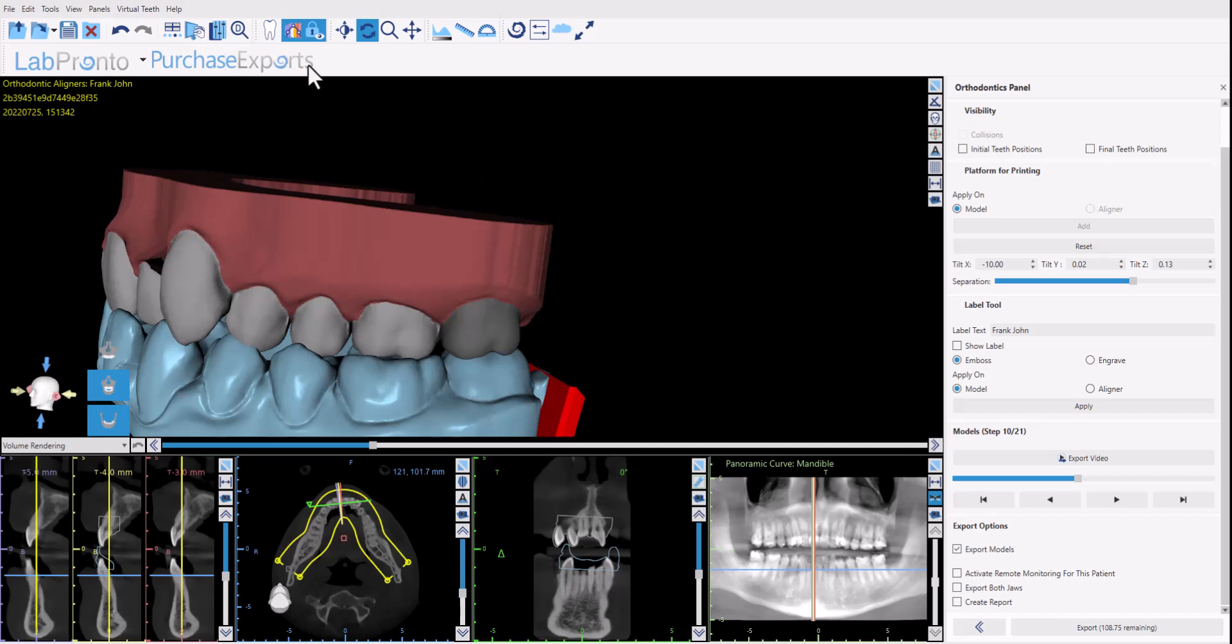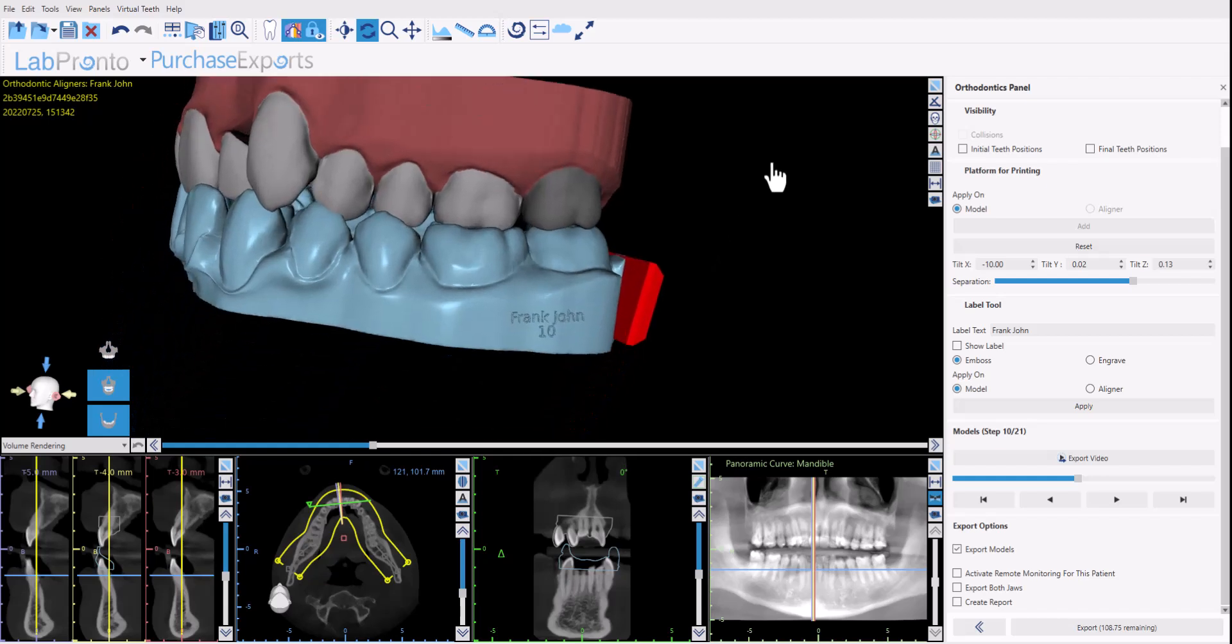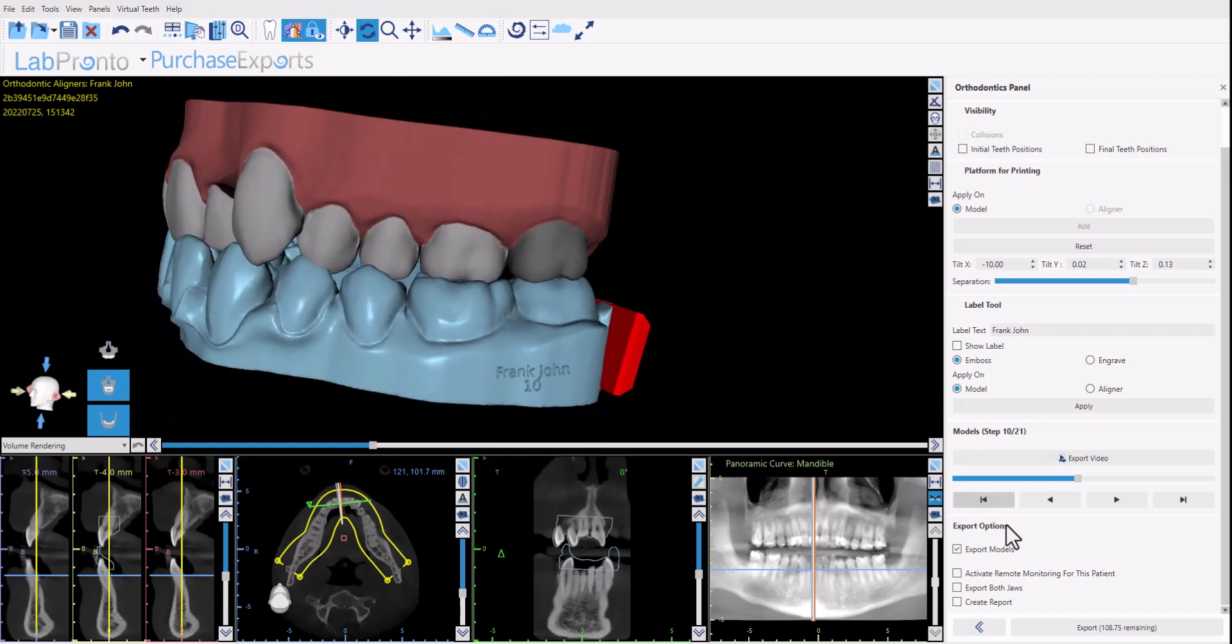We're going to have a separate video that demonstrates the functionality and the capabilities of the remote monitoring platform but that's what this checkbox does. At a very low patient fee, one time fee per patient. There's no monthly fees. You could activate the remote monitoring for the patient and the first five patients are completely free so you could get used to the platform and get used to your first cases.